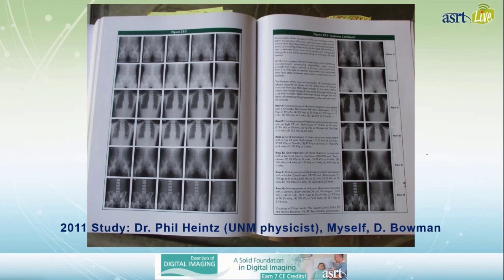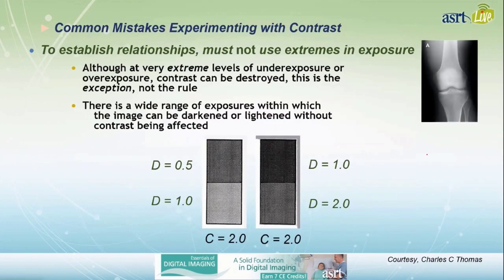And we went into great detail. We had other educators send in samples from their particular brands of equipment. We traveled to get these different brands. We studied 11, we collected data on 11 of the 13 manufacturers. This is the kind of thing you need to do to establish a concept, to generalize concepts that we're going to teach when we're dealing with digital.